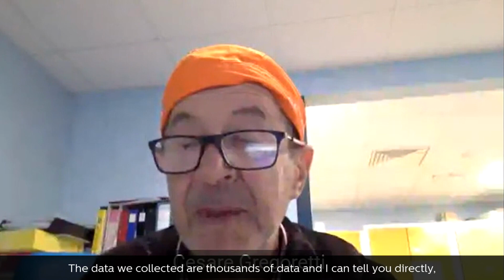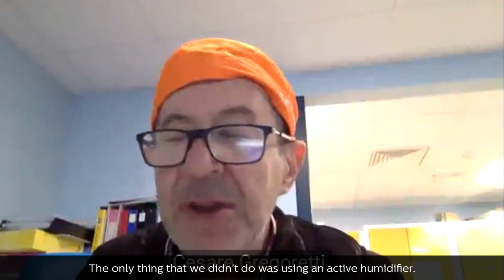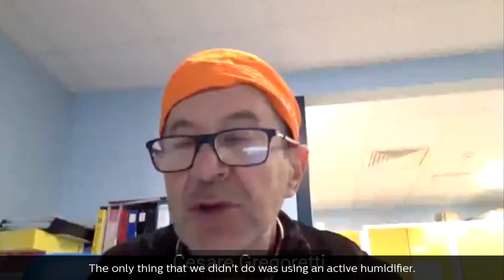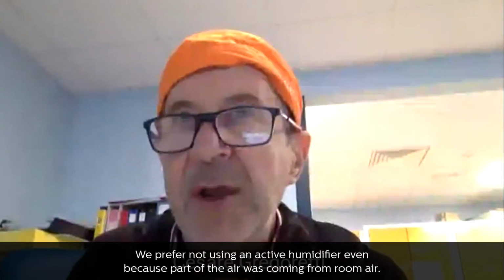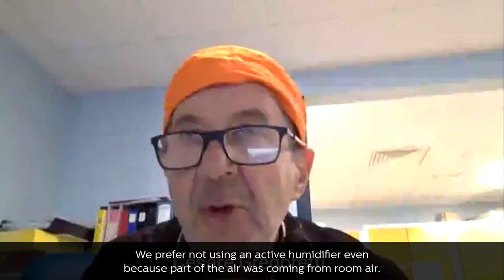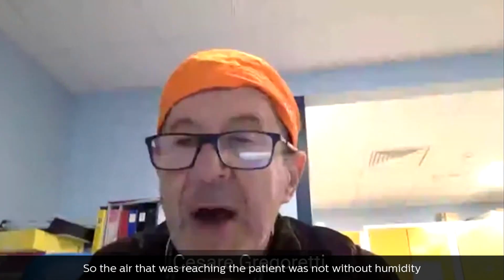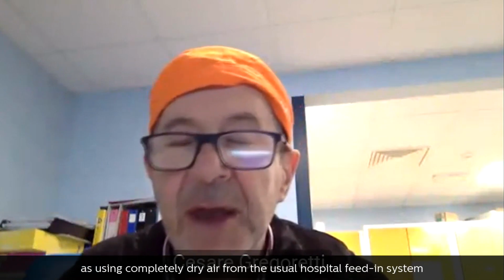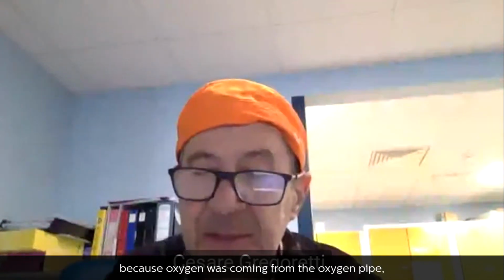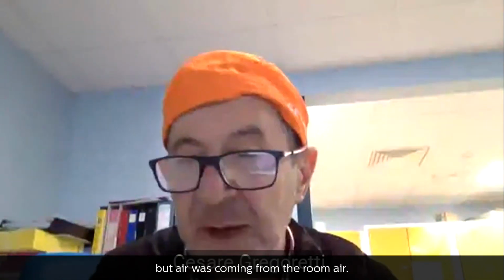The data we collected are thousands of data points, and I can tell you that the device was very well tolerated by the patients. The only thing we did not do was use an active humidifier. We prefer not using an active humidifier, also because part of the air was coming from room air. So the air reaching the patient was not completely dry as with the usual hospital feeding system, because oxygen was coming from the oxygen pipe, but air was coming from the room.